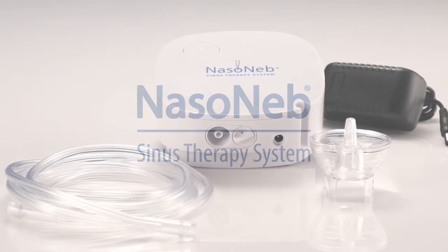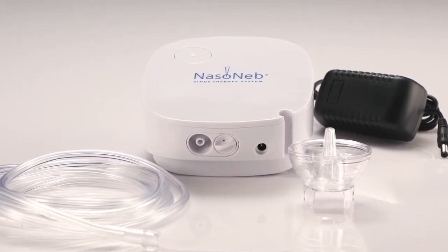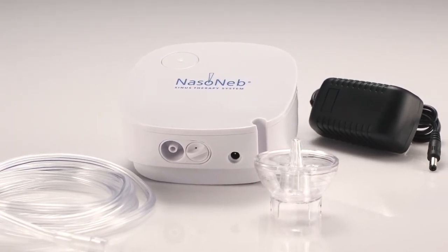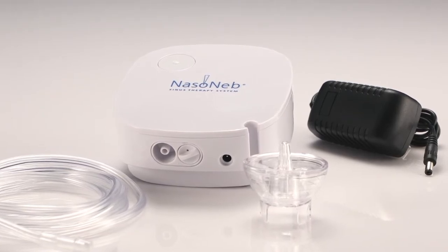This video is intended to demonstrate the use and care of your Nasoneb Sinus Therapy System. It is not intended to replace the instructions for use manual. Please read and become familiar with the instructions for use prior to using your Nasoneb Sinus Therapy System.